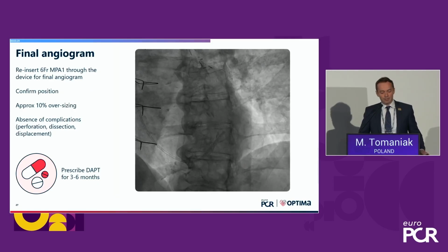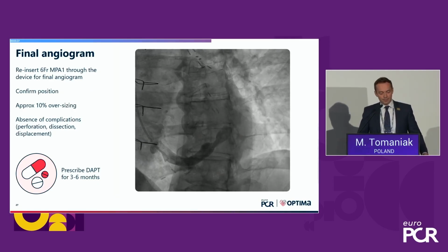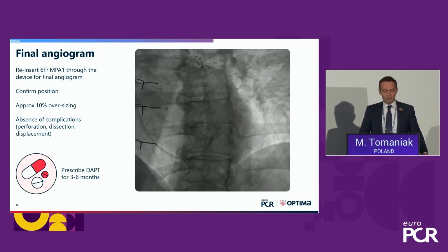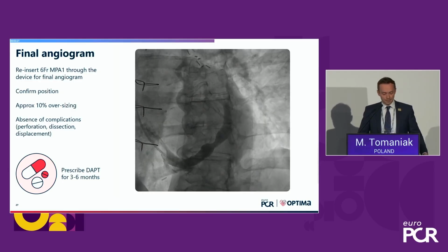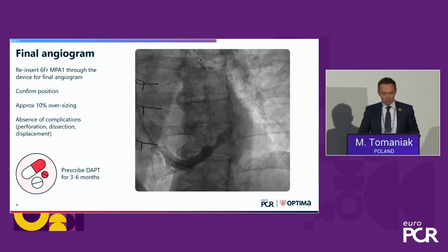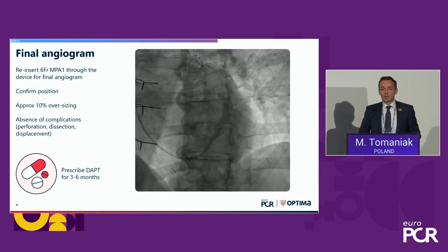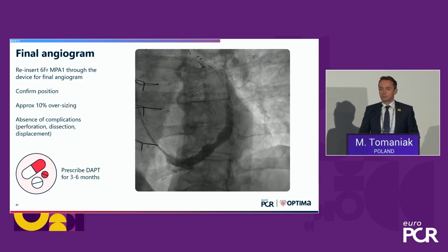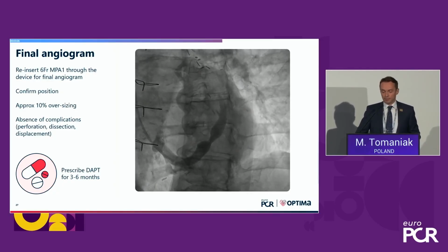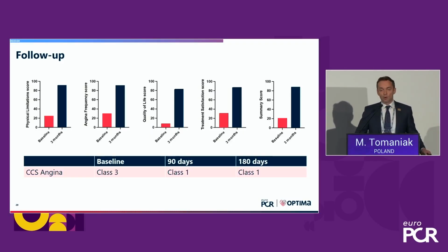So now I reinsert MPA through the device just for final angiography, confirm position, confirm the desired around 10% oversizing, and the absence of any complications like perforation, dissection or displacement. I prescribed for this lady DAPT for 3 months, comprising aspirin and clopidogrel, and then she continued on aspirin lifelong. So we follow her up as we usually do in our outpatient clinic.